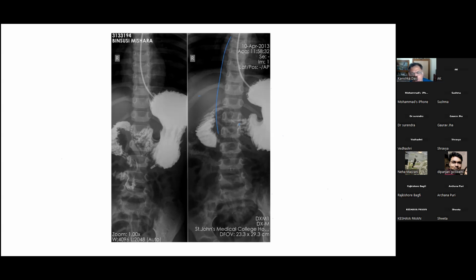Barium meal follow through or contrast follow through? Is it like a follow through? Very often you see films with follow through, so how is it different? This is more like a swallow that we do, and then under fluoroscopy we assess. You want to see the upper bowel only. You want to see the DJ.